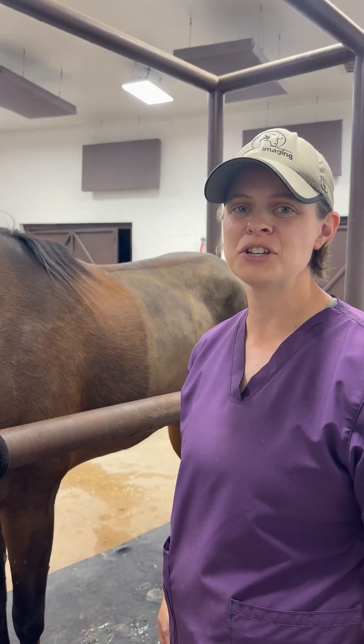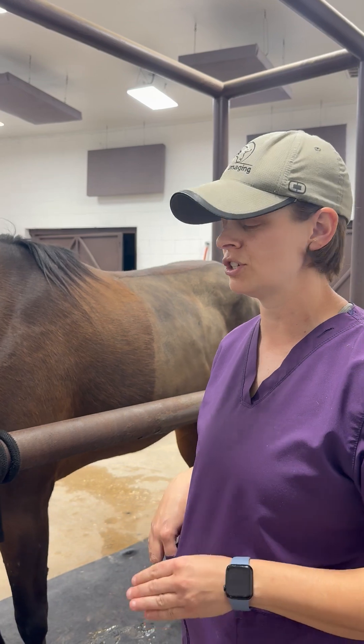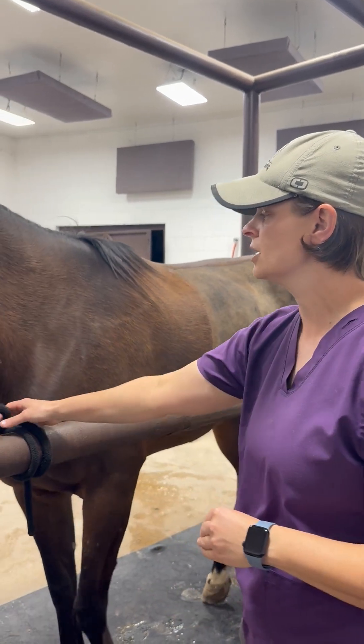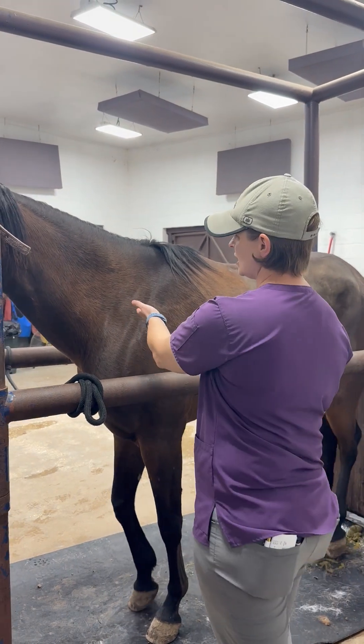We're going to talk through how to do IM injections on the horse. There are three main places that you should do an IM injection on a horse. The most common, easiest, and safest for you and the horse is the neck.